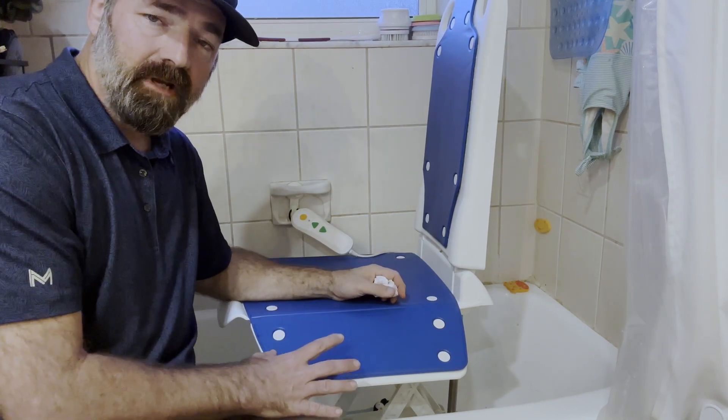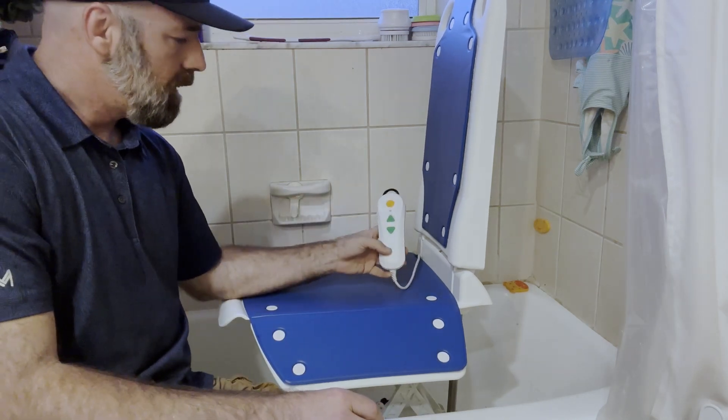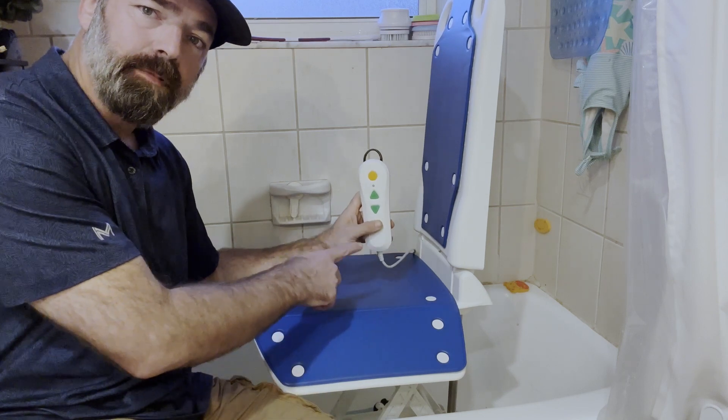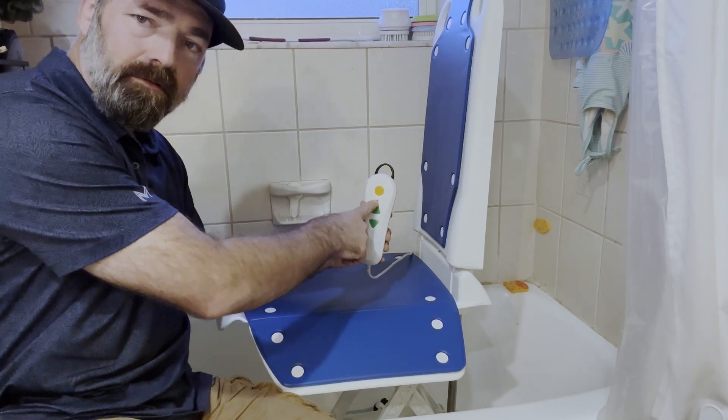There are six suction cups on the bottom to make sure it sticks to the tub. The controller has a built-in battery — you don't have to plug this in. It purely runs off the battery, and you have an indicator light on it.